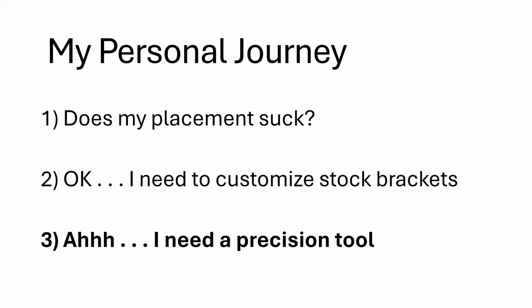And so I got home and I realized, yeah, the system I was using had an incredible amount of slop. And slop is how far you can rotate that wire.